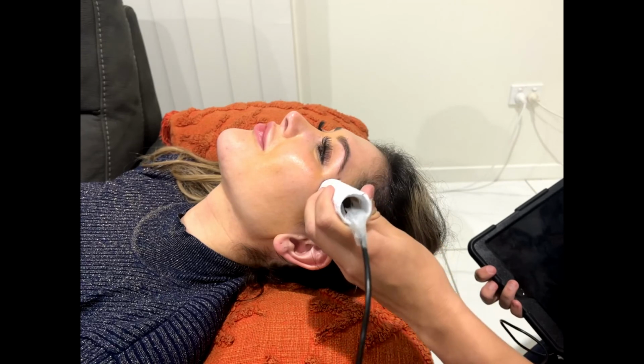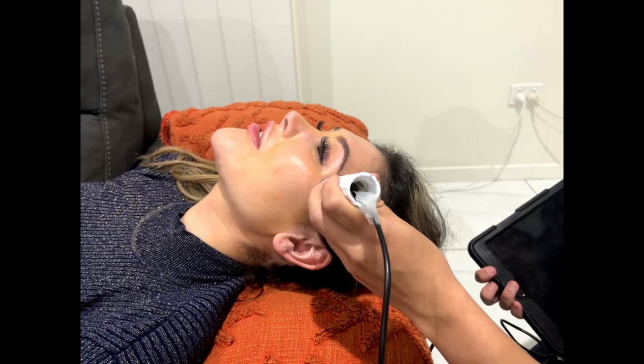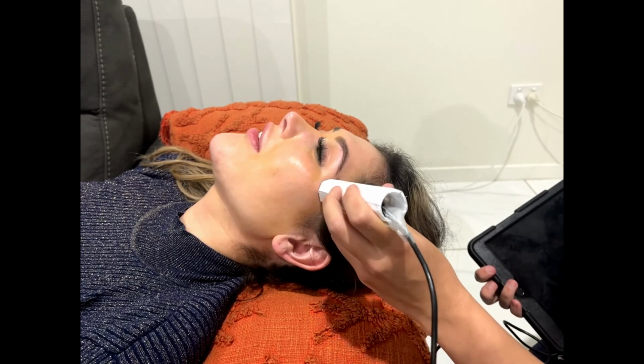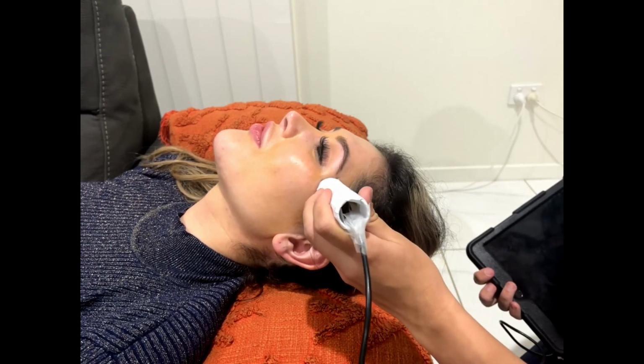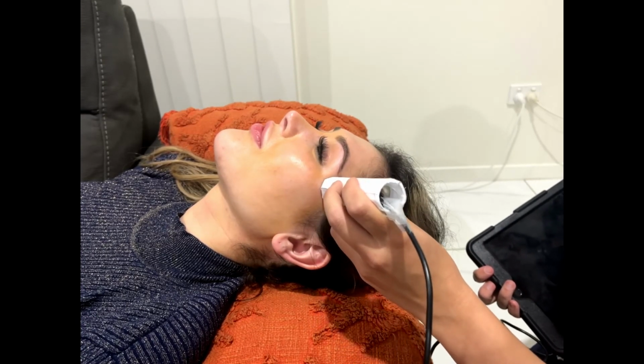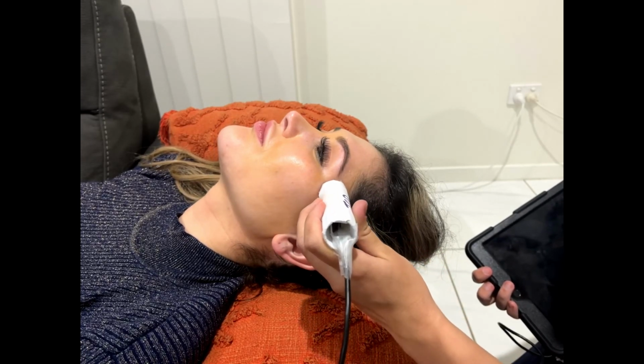Blood flow velocity is one of the main criteria for judging the pathophysiological state of the blood vessels and is usually measured in centimeters per second. Spectral waveforms allow for this assessment. Studies conducted by Ali 2021 and Zhu et al. 2019 noted that transcranial Doppler may be used in the assessment of subarachnoid hemorrhage.